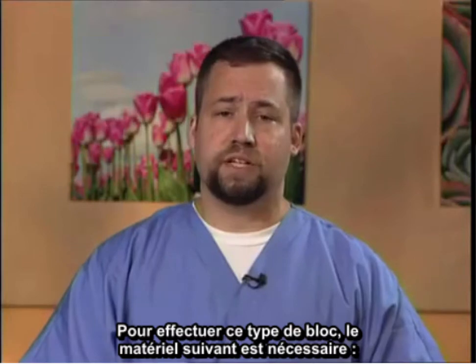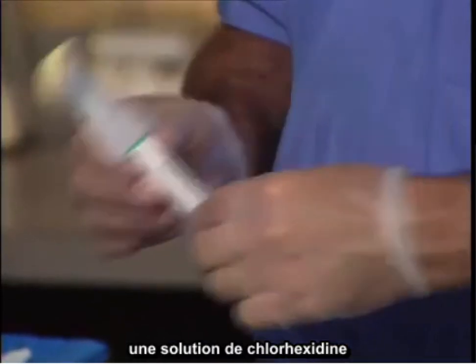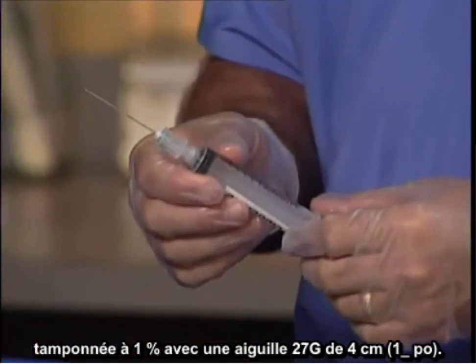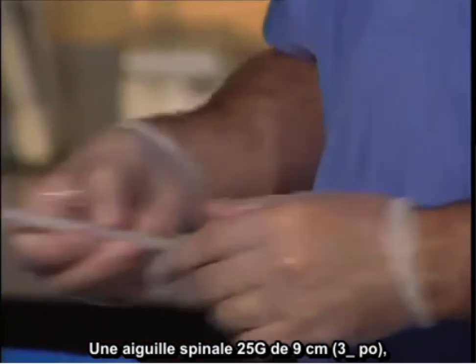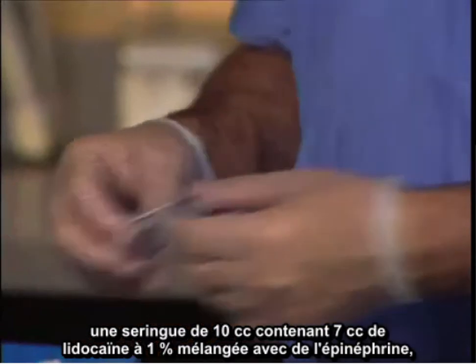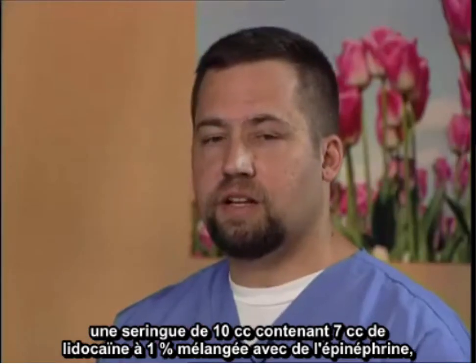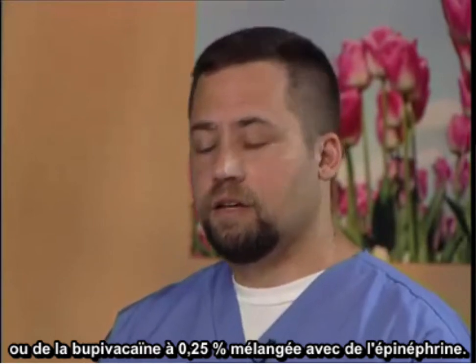To perform this particular block, the following equipment is necessary: the chlorhexidine prep, 1% buffered lidocaine with a 1.5 inch 27 gauge needle, a 25 gauge 3.5 inch spinal needle, and a 10 cc syringe containing 7 cc's of 1% lidocaine with epinephrine or quarter percent bupivacaine with epinephrine.